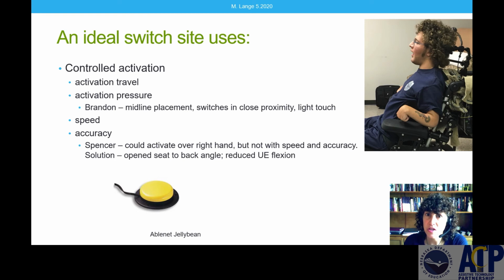Speed is also a consideration. We want our client to be able to readily get to the switch and it not to take a long time, or this task will become very frustrating for them, frustrating for others. It will slow down their scanning speed.